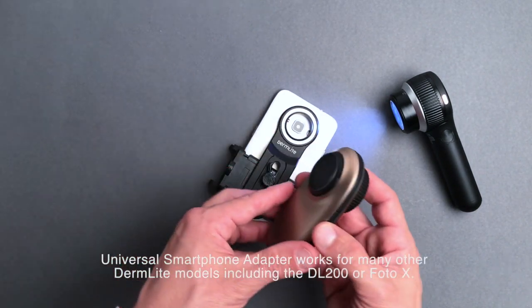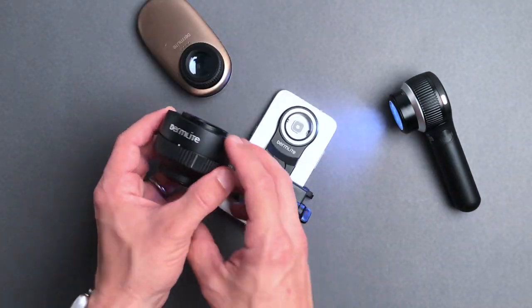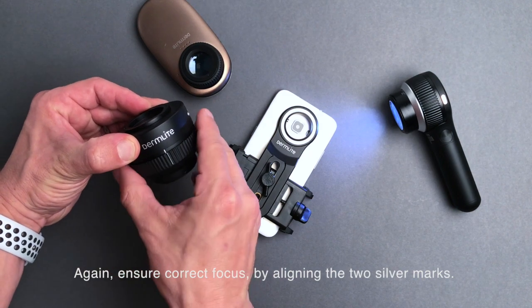The Universal Smartphone Adapter works for many other DermLite models, including the DL200 or Foto X. Ensure correct focus by aligning the two silver marks.